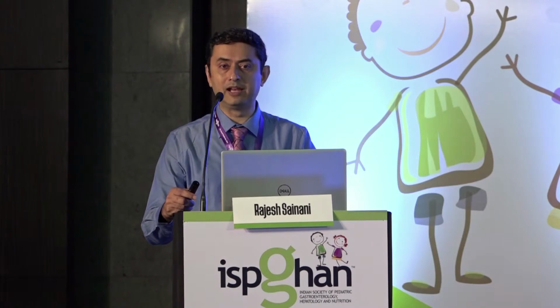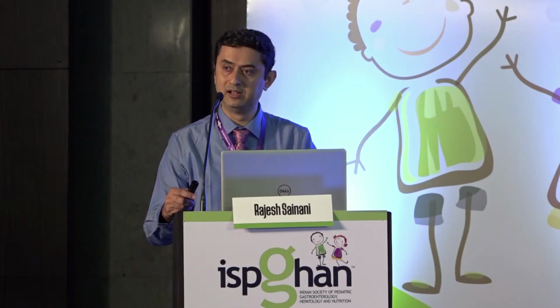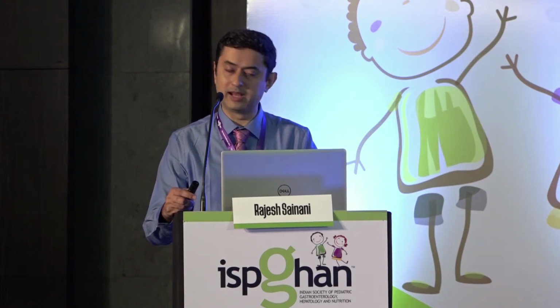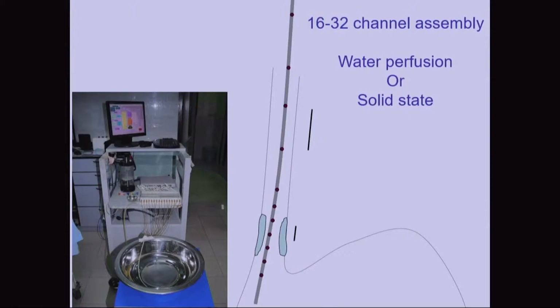We need to evaluate esophageal motility prior to fundoplication and even in patients post-fundoplication to assess the level of dysphagia. Rarely we get a referral for diagnosing rumination, and of course we need a manometry to localize the LES prior to the pH probe placement. So how do we do the test? We use 16 to 32 channel water or solid state catheters. In our center we use a water perfusion catheter.